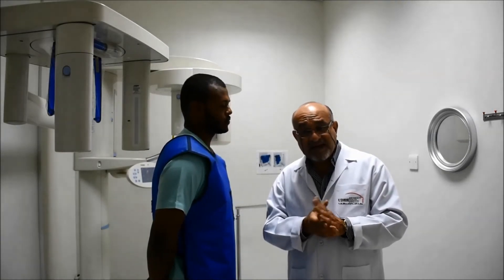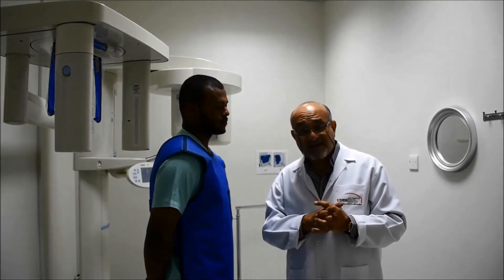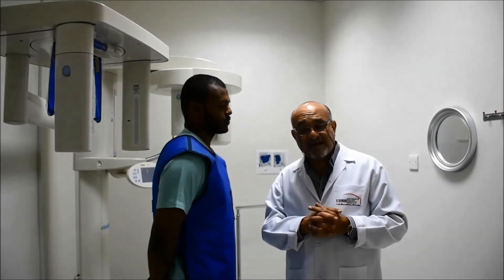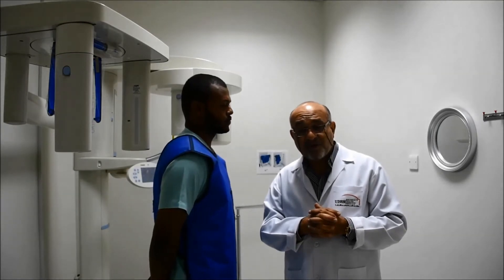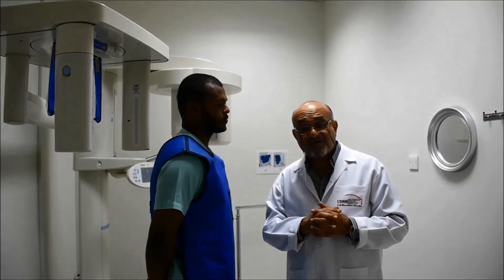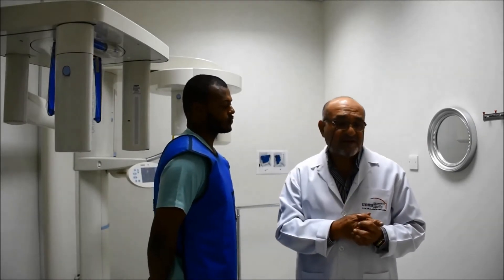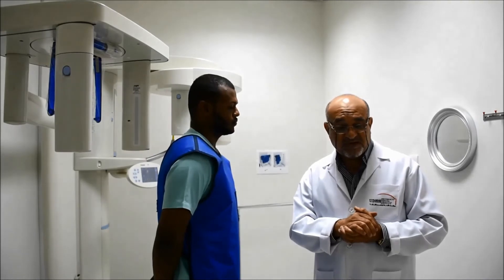Make it a habit to ask about pregnancy. Any lady who thinks she may be pregnant should be asked. If an x-ray is truly necessary, all protective measures must be applied. Both lateral ceph and OPG involve longer exposure times and higher radiation doses, so if possible in an emergency, shift to a periapical radiograph. We do not want to expose the fetus to unnecessary radiation.